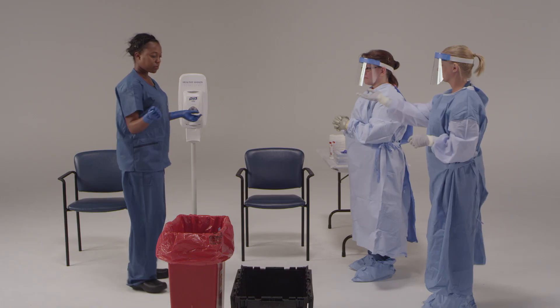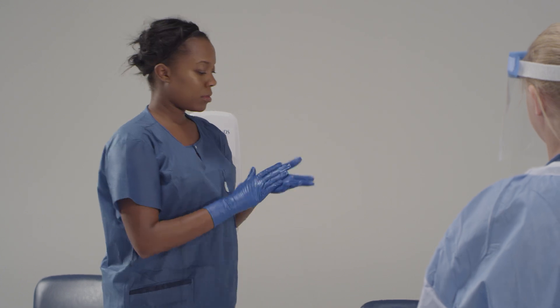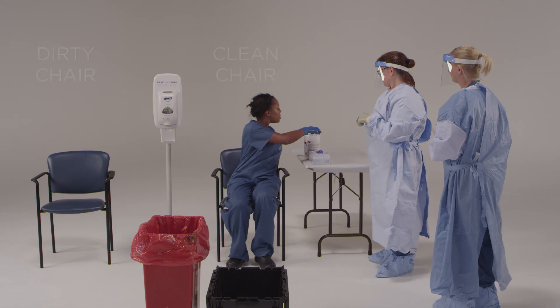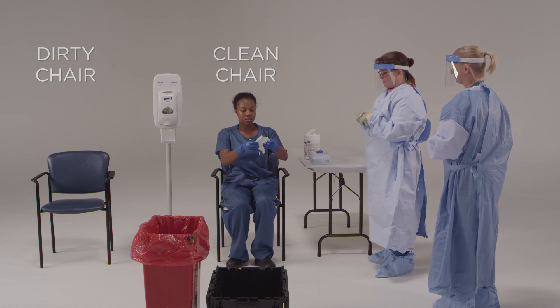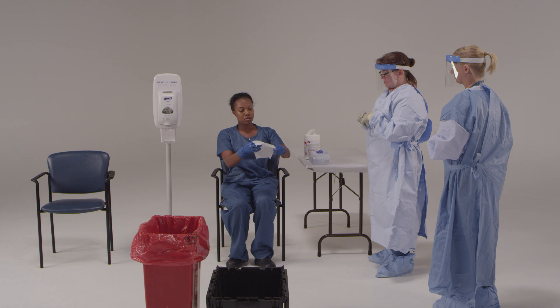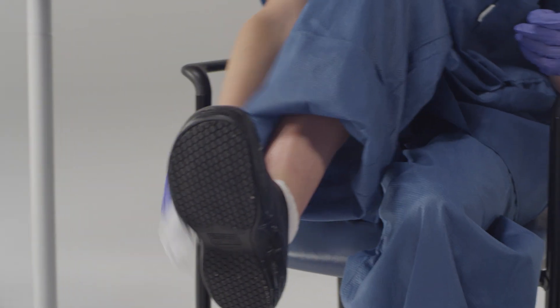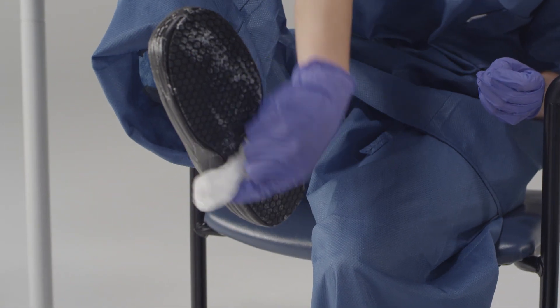You're doing great. Now go ahead and disinfect your gloves. Please have a seat in the clean chair so that you can disinfect your shoes. Sit down in the clean chair, then use the EPA-registered disinfectant wipes to thoroughly disinfect all the surfaces of your shoes, moving from top to bottom and including the soles. Be sure not to touch your ankles.